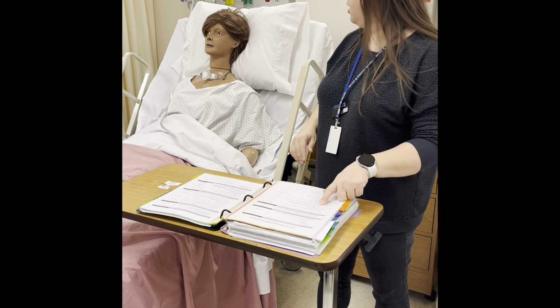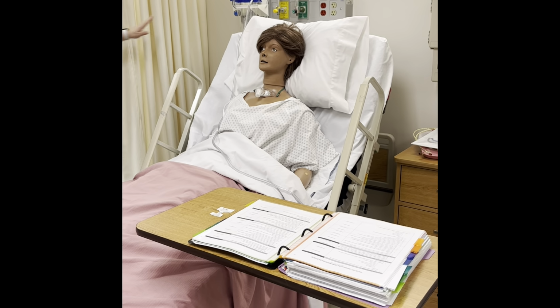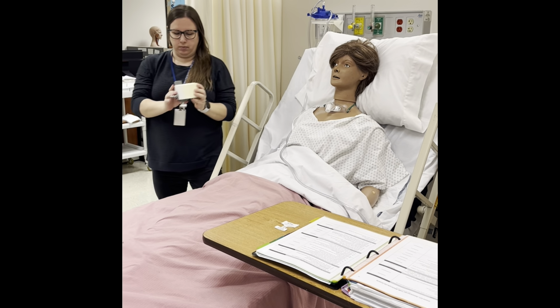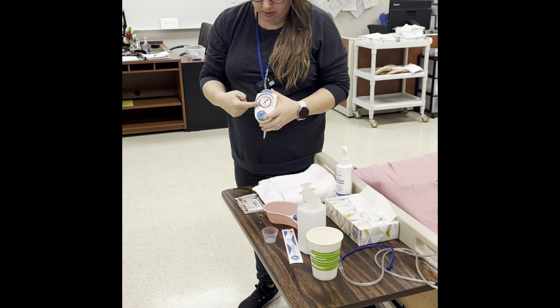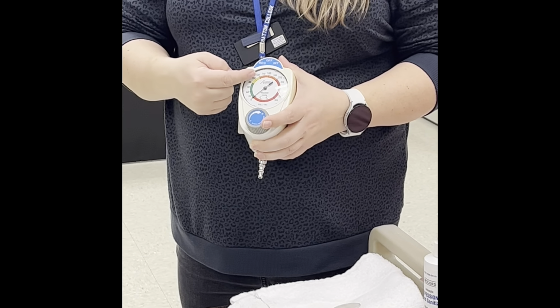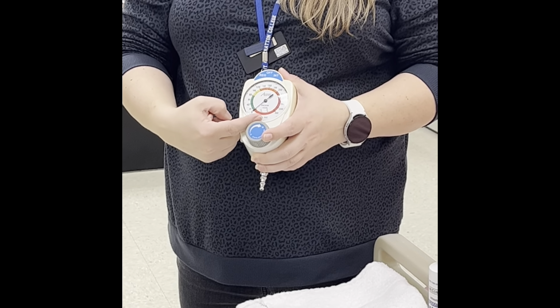Next, we're gonna turn on the suction device. So suction, I'm too far away, is this one right here. It's a vacuum. This vacuum should be in the room. As you can see, the vacuum has different levels: green, yellow, orange, red. Green is where we're going to suction on low intermittent suction for an NG tube. It should go from 0 up to 80, back down.